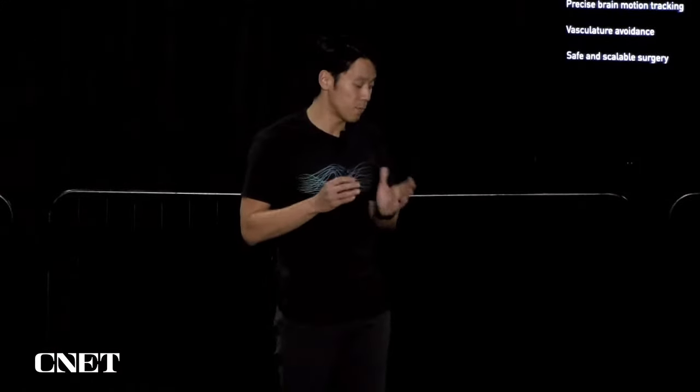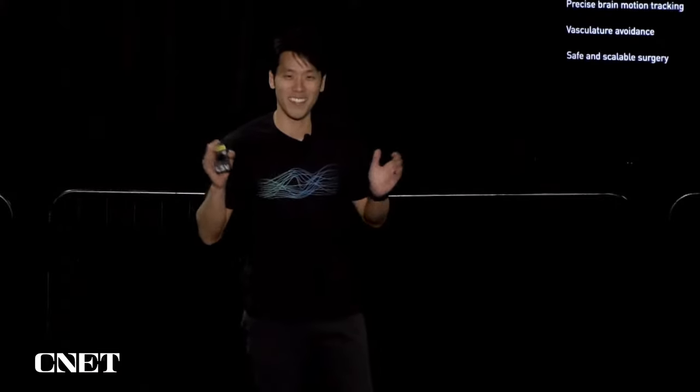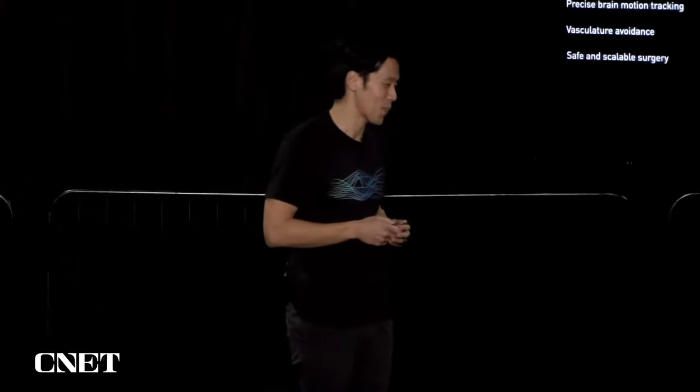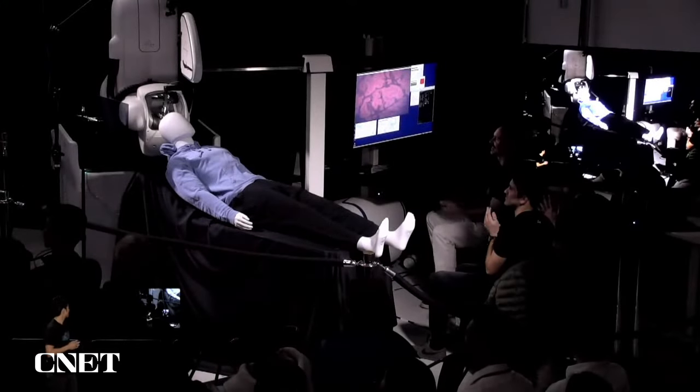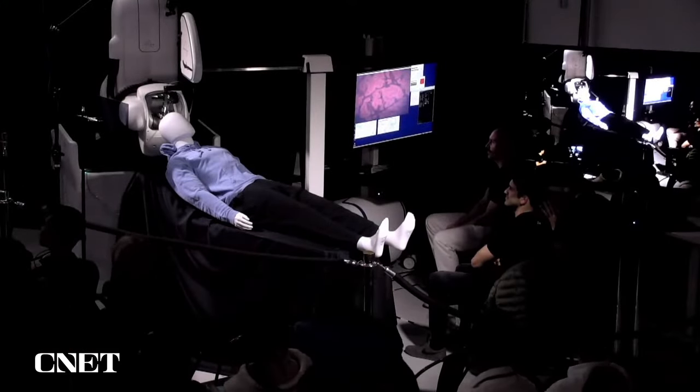It's quite good at doing this reliably, and in fact, because we've never shown an end-to-end insertion of a robot in action, we're going to do a live demo of the robot doing surgery in our brain proxy. So who wants to see some insertions?